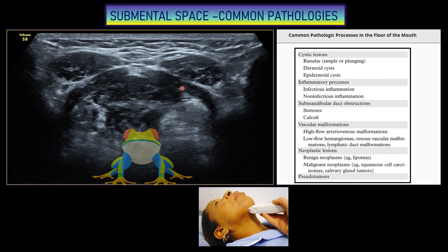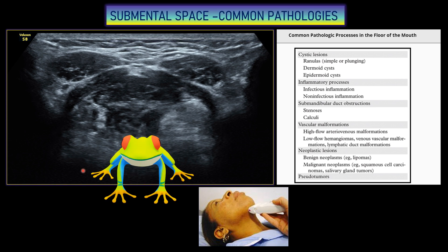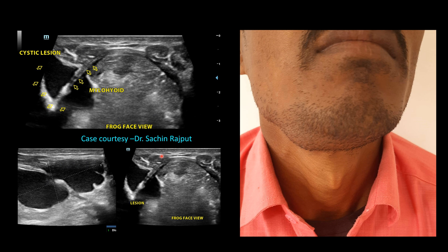This is the typical frog face appearance. Next we will look at a case — the patient presented with swelling in the submandibular region on the right side. Here you can see the swelling in the submandibular region.